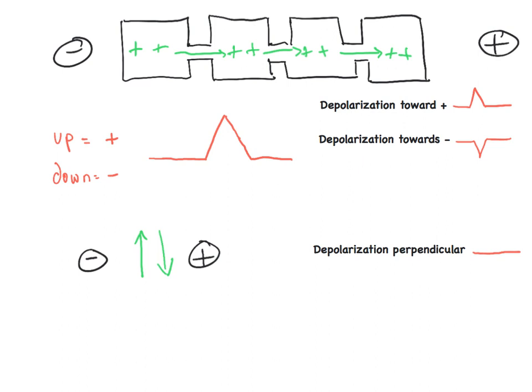ECG tracings are dominated by 2 factors: the direction of the depolarization event, which is known as the vector, and the mass of the cells within the depolarization event. The more cells or more mass within the depolarization event, then the stronger the deflection will be recorded on the ECG tracing. I hope this will make sense using an example.